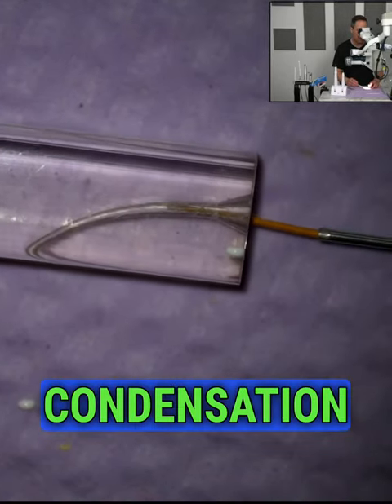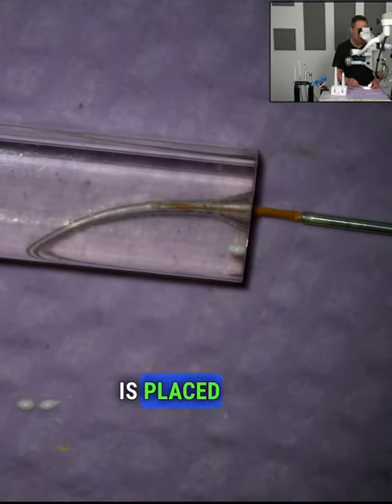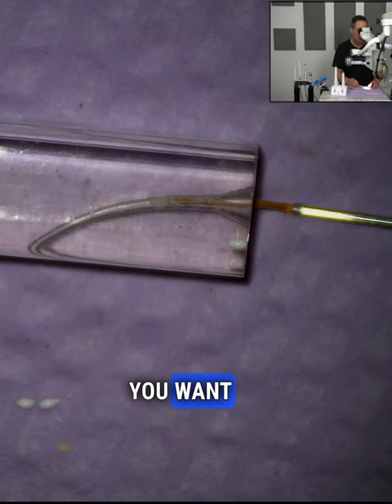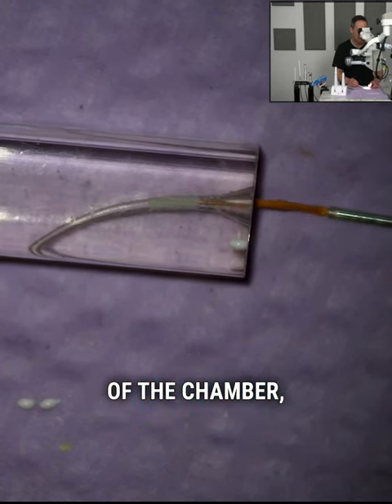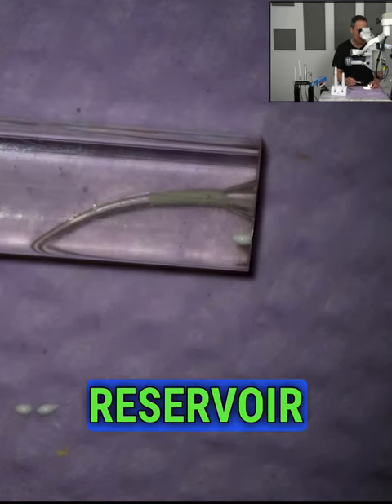Here's a quick demo of the hydraulic condensation technique. You can see the sealer is placed into the coronal third. You want to express some of this BC sealer right up in that coronal third of the chamber, slowly adding it and creating a nice little reservoir there.